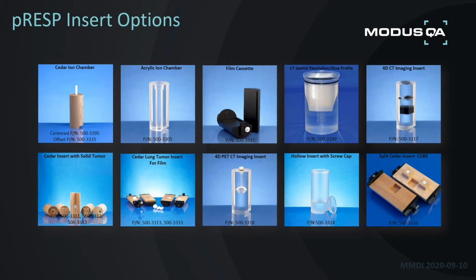So we do offer an extensive library of inserts for the pRESP Phantom, and you can see here there's quite a few of them. I'll just go over them very quickly, but by all means, if you ever have any questions on any of these, definitely feel free to contact us. We do have here just a cedar insert that can have an ion chamber placed within it, and the same thing but in acrylic. And with these inserts, you can have it drilled for the ion chamber, but you can have it centrally located or offset if you want to use 3D motion.